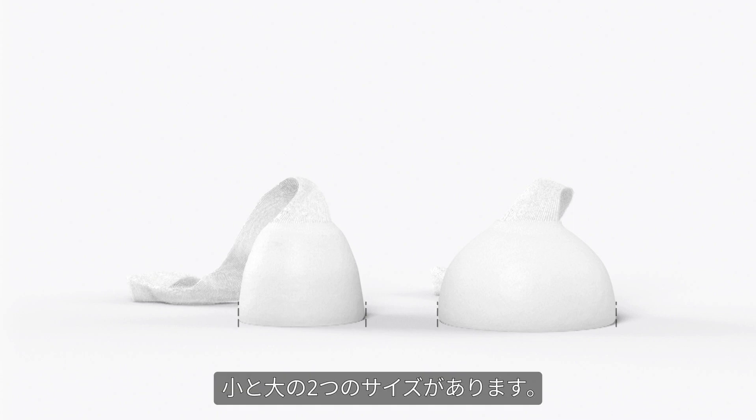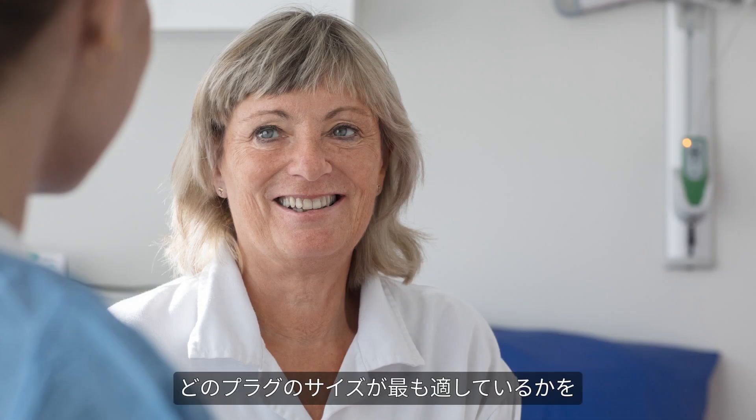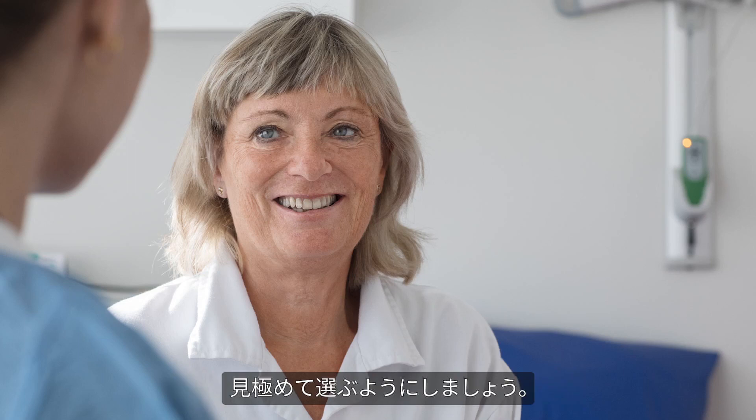It's available in two sizes: small and large. When you talk to patients, try to help them determine which anal plug size works best for them so they choose the one that is most effective.